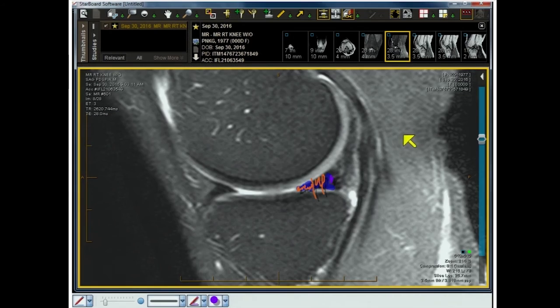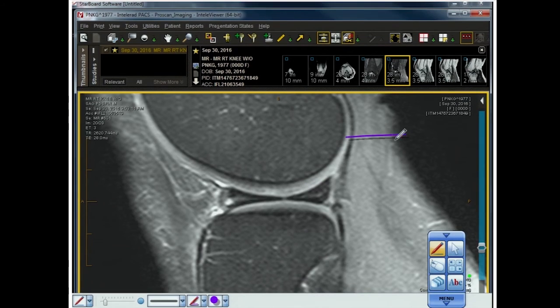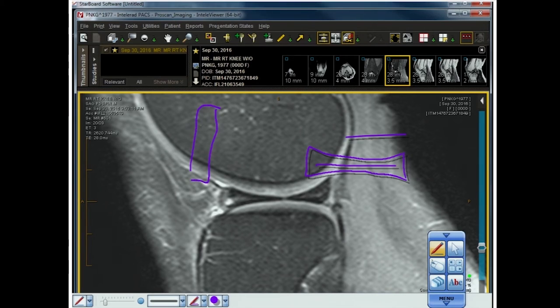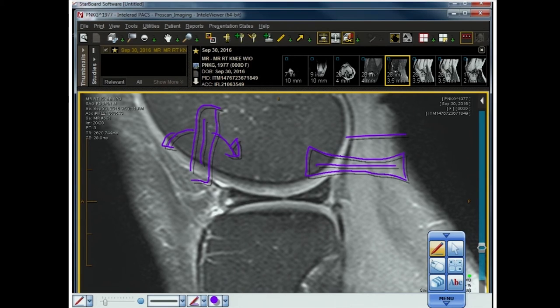It's a meniscus that's turning into a turkey sandwich. Here — let me use the drawing tool — there in purple is my discoid meniscus. The tear is just going right down the barrel, through the center of the meniscus, right through those weaker collagen bands where the conduraniovium is a little looser. Unfortunately, in these dysplastic menisci that loose area starts to come apart. If you put it on the table and turn it vertically, one half falls one way, the other half falls the other way — the two pieces of bread from the sandwich fall apart, and you've got just a piece of turkey in the middle.